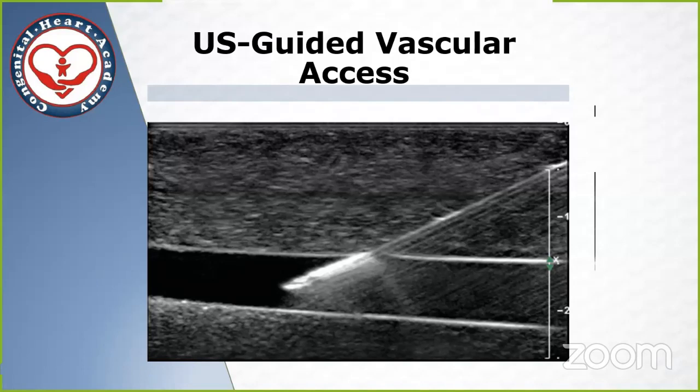And people were not trusting our capability, but now things have changed, and it's relatively difficult to see a new trainee accessing a vessel without the use of ultrasound, which is also a problem, but it has helped us a lot to decrease the morbidity in our patients.